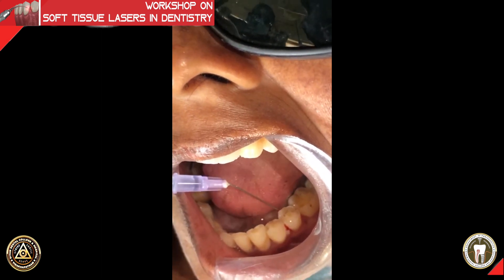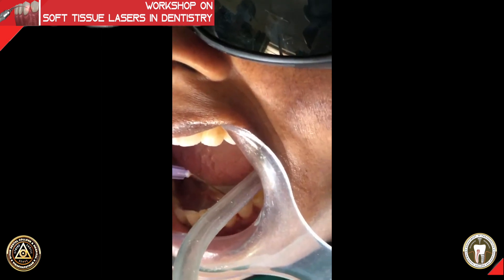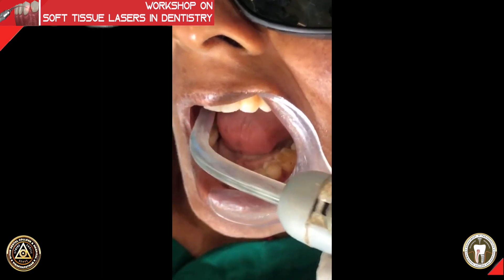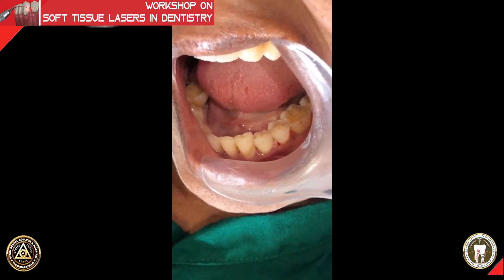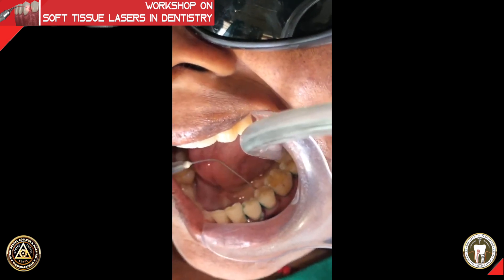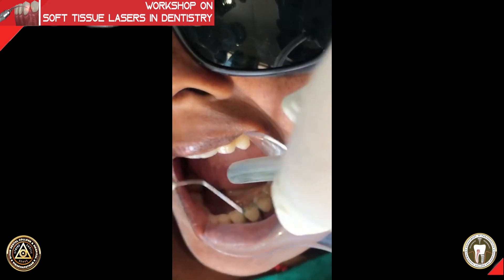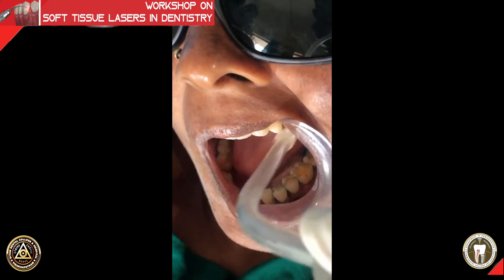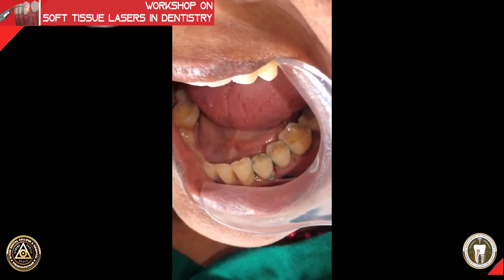We are pumping the dye in place. Now we are balanced and we will wait for the binding time of one minute. We are going to wait for one minute and then start.